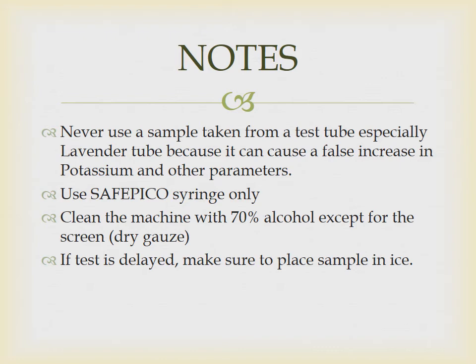Clean the machine with 70% alcohol except for the screen. A dry gauze should be used. If the test is delayed, make sure to place the sample in ice.